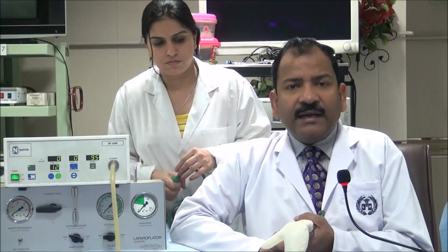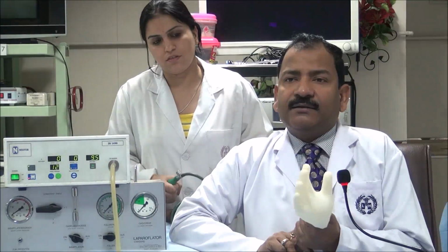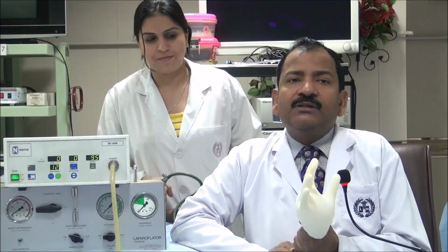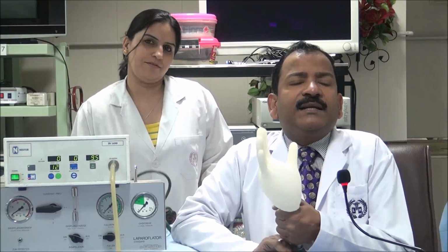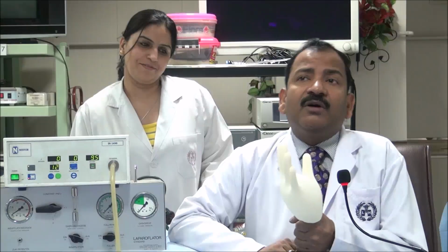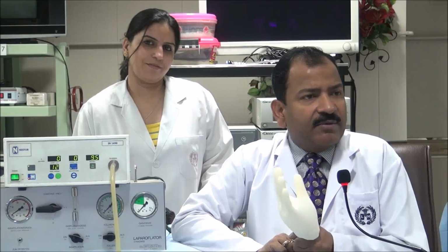She is pumping and the abdominal cavity will inflate. Of course it is air, so it is a little risky. But remember, once you have already started the surgery, it is not much, because the maximum risk is during the entry. If you keep the pressure less than 12, then there will be no air embolism, unless you are doing vigorous dissection with high pressure and any open venous sinus is there. Otherwise it will not be a problem.